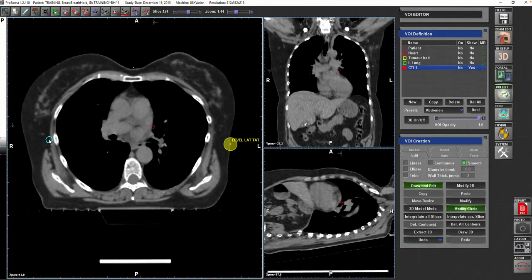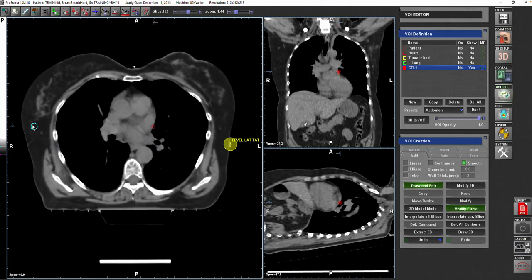modification that happened in the ESTRO guidelines. The first paper was published, but then a modification happened that, I don't know why, is not very famous; when I talk about it, not everybody is aware of it. In the modified version of the ESTRO guidelines, they were talking about a vessel called the lateral thoracic vessel, and this vessel here they call the lateral edge of the breast tissue.